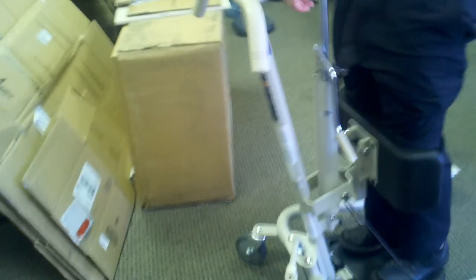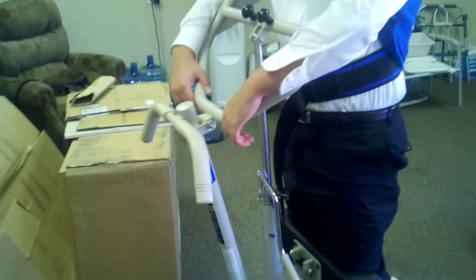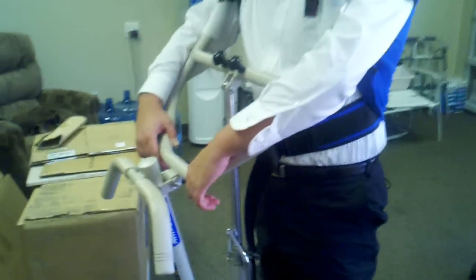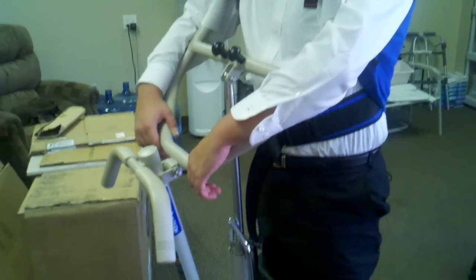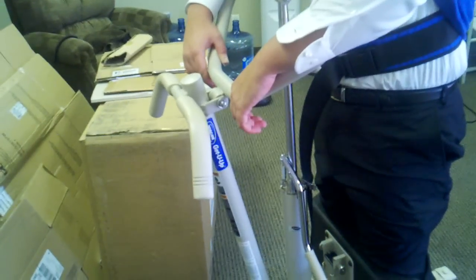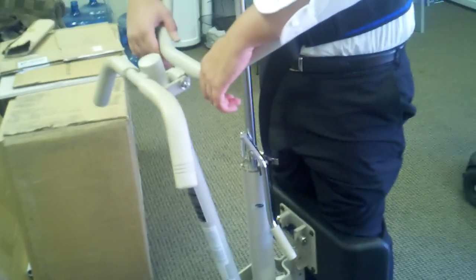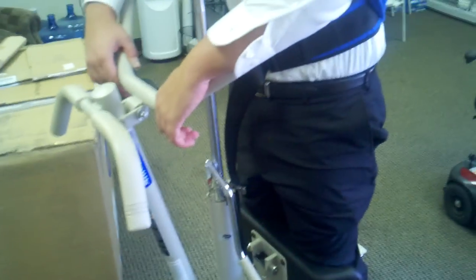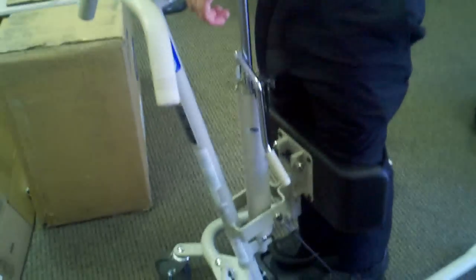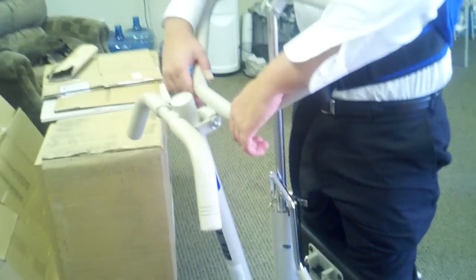This is the patient lift by GoSouthernMD.com — the Invacare GH-S350 Get You Up Hydraulic Stand-Up Lift. It's listed on our site for $899, brand new in the box from the supplier with free shipping. And if you go to our rental category, this is what you're going to similarly get, except that it will be a patient lift with a boom and not the stand-up one. You can see how easy these lifts are to use.